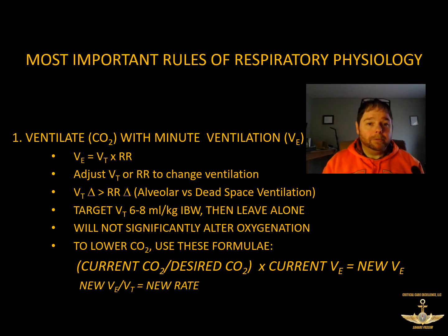Whatever you do with minute ventilation, it's not going to significantly alter your oxygenation unless they're not ventilating at all. So if you have somebody who is in profound respiratory failure that is uncorrected, then their CO2 is going to be high and their oxygen saturation or their PO2 is probably going to be low, just because they're so full of CO2 there's no room for oxygen. So you have to get that out of the way.